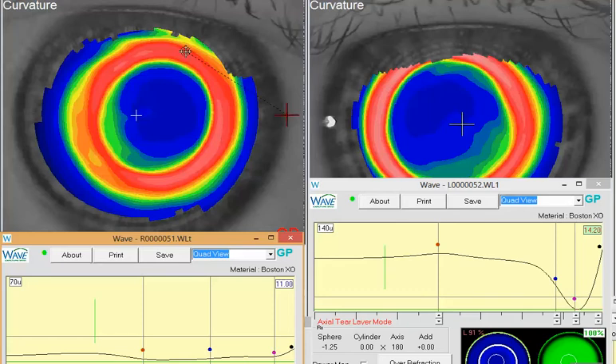Second thought: looking especially at this right eye, you have a decentered optical zone. Here's the visual axis, and you have a decentered optical zone. So I would predict, looking at this cornea, that you're probably going to run into some haloing issues — this is the transitional zone on that cornea. Even though you're trying to put a nice vaulting surface over the top of this, you still have a cornea that's structurally altered and irregular, so I would anticipate some glare issues.